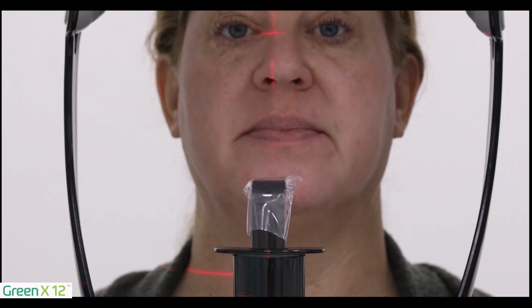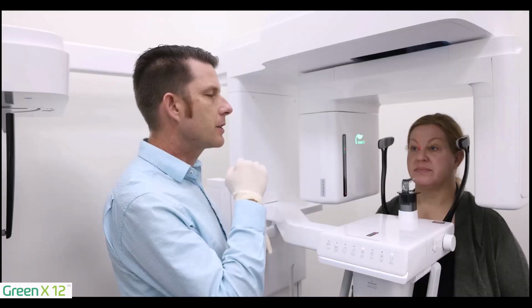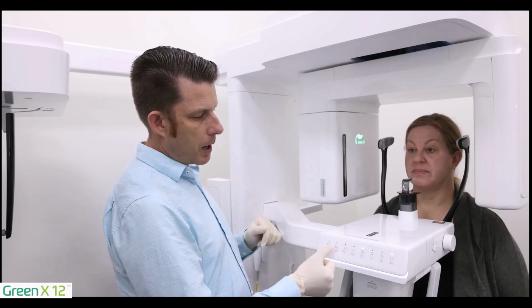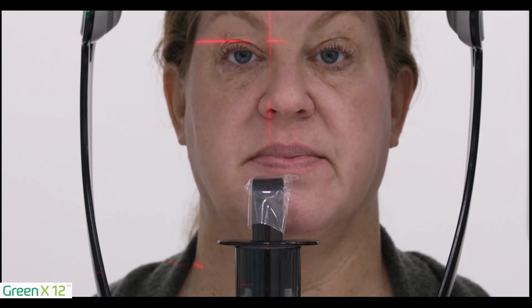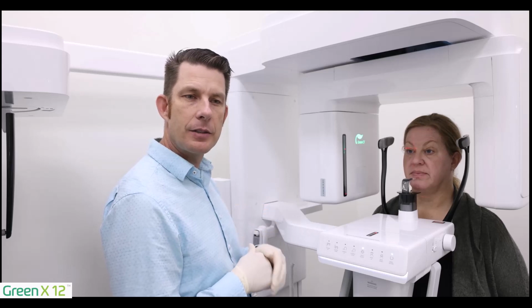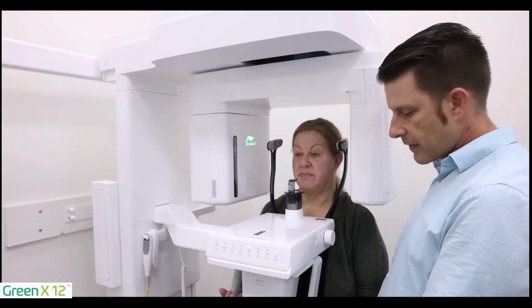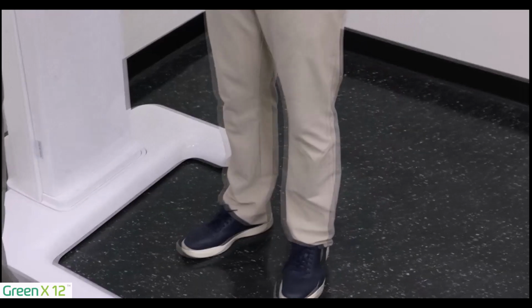The first thing I do is I evaluate the chin rest to the base of her chin. I want the patient to be able to just put the chin on the chin rest. So I'm going to evaluate that, column up or column down to adjust. Then I'm going to start with the patient's hands, feet, and then finally have the patient bite in the bite stick. So let's start with the hands first. I'm going to have my patient hold on the hand rest with their palms facing up. Walk forward and have your feet shoulder length apart.